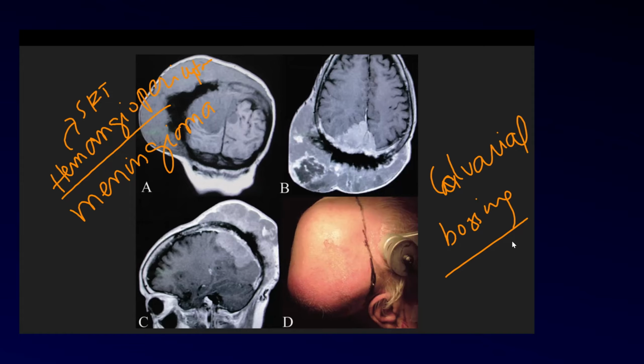Okay, Dr. Noor, I was only able to hear part of your answer. I think there is some problem on your end regarding the audio. So, yes, flow voids are a good answer. Apart from flow voids, what other things can we see? I think on the CT, we can differentiate via the bone changes. Exactly. What is that? On SFTs, it will be destructive, so it will have an osteolytic appearance. Exactly. As for intraosseous meningioma, you will see hyperostosis.